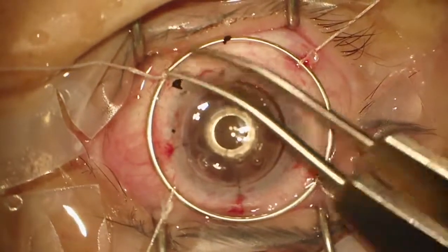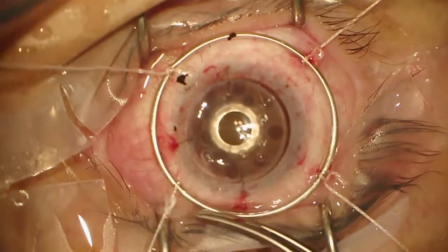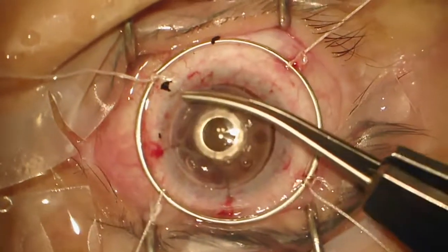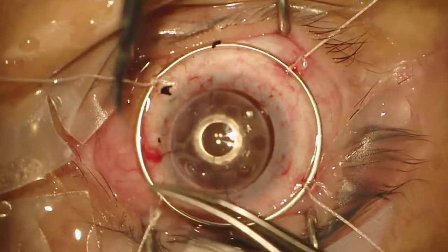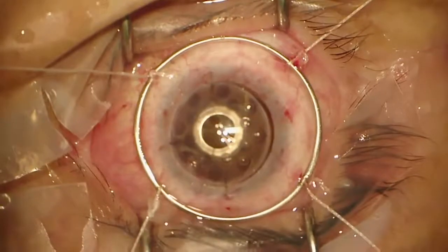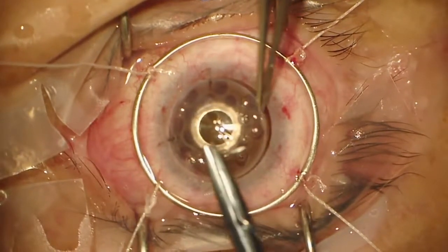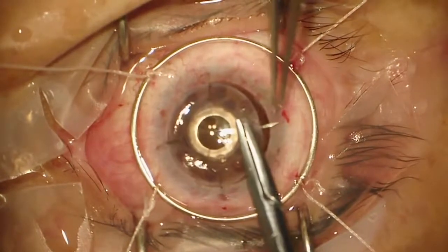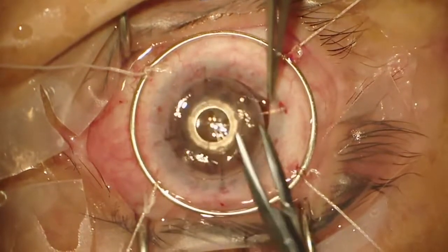So I saw from the beginning that we had some posterior pressure and decided to hold off on the PI. Then the lens was pushed out. The lens was put back into position. Once we've got the cardinals in, we can go back and do a peripheral iridotomy. Suturing here is a little bit different from doing a PK. The sutures are actually harder to get into position.